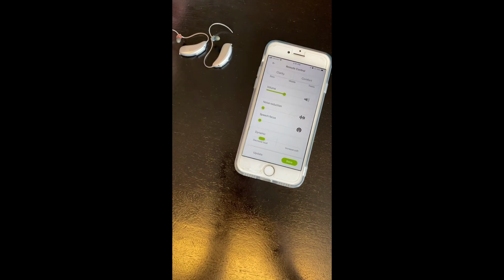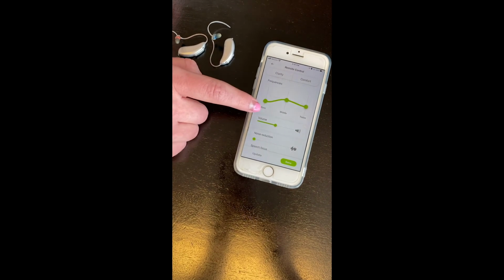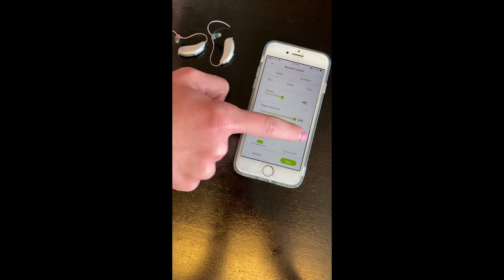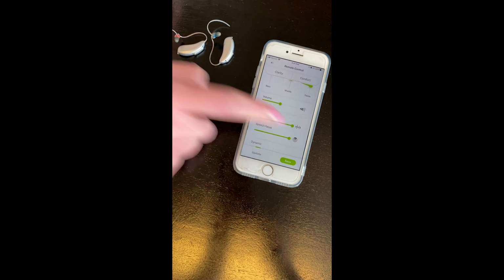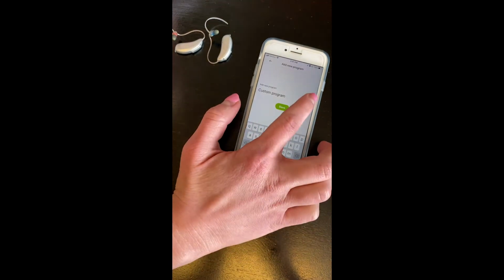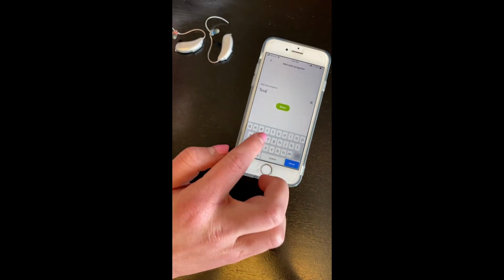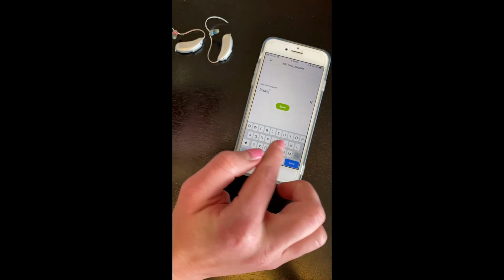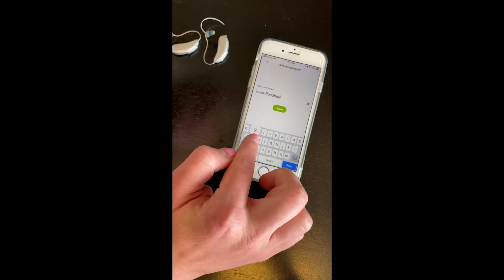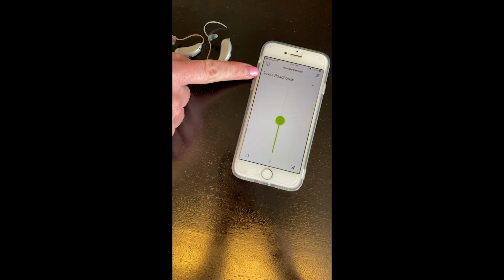Let's say you are at Texas Roadhouse and you take this out. The music is just really loud, and so you mess around with it until it sounds really good. So you turn down that noise and try to focus more on what your wife or husband are saying. And then you can save it. And we're going to save this program so that it is called Texas Roadhouse. And then we're going to save that. Okay, so now it's in our Texas Roadhouse setting.